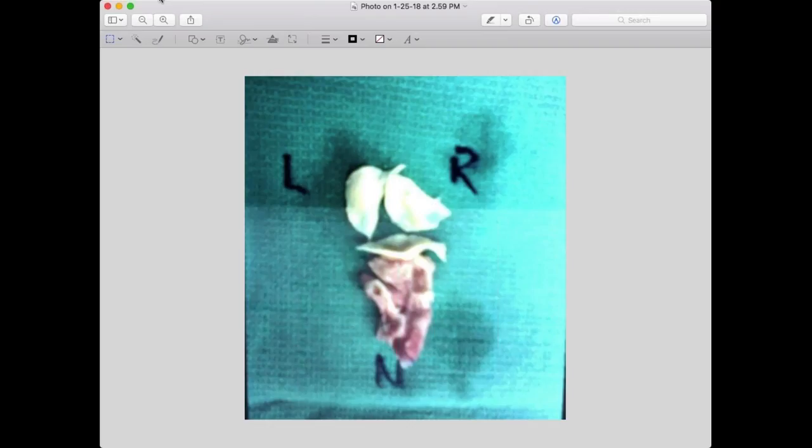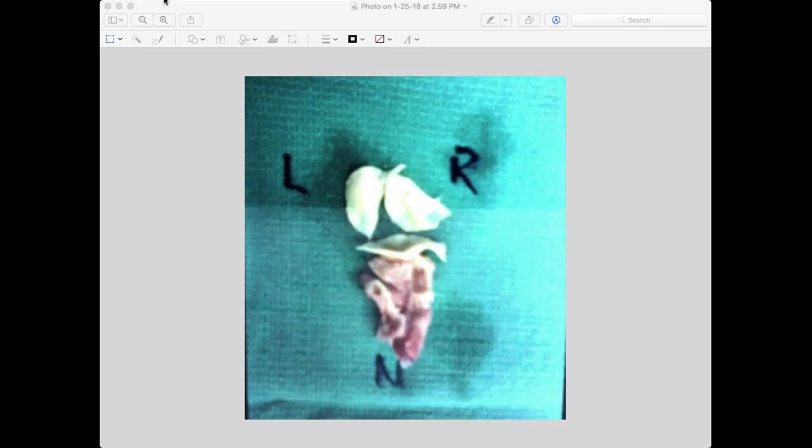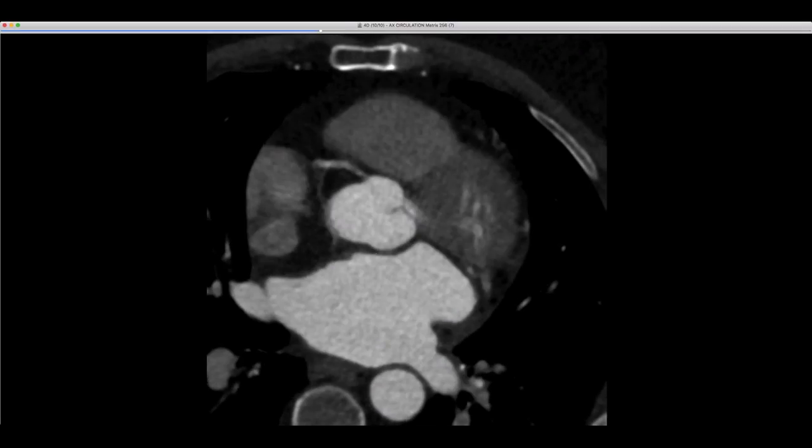Has anyone ever seen a larger thrombus than this adherent to one of the valve leaflets? She had had prior echoes and nothing was there — this was a new abnormality. Not sure exactly what the interval was, but just shocked by that dramatic appearance.